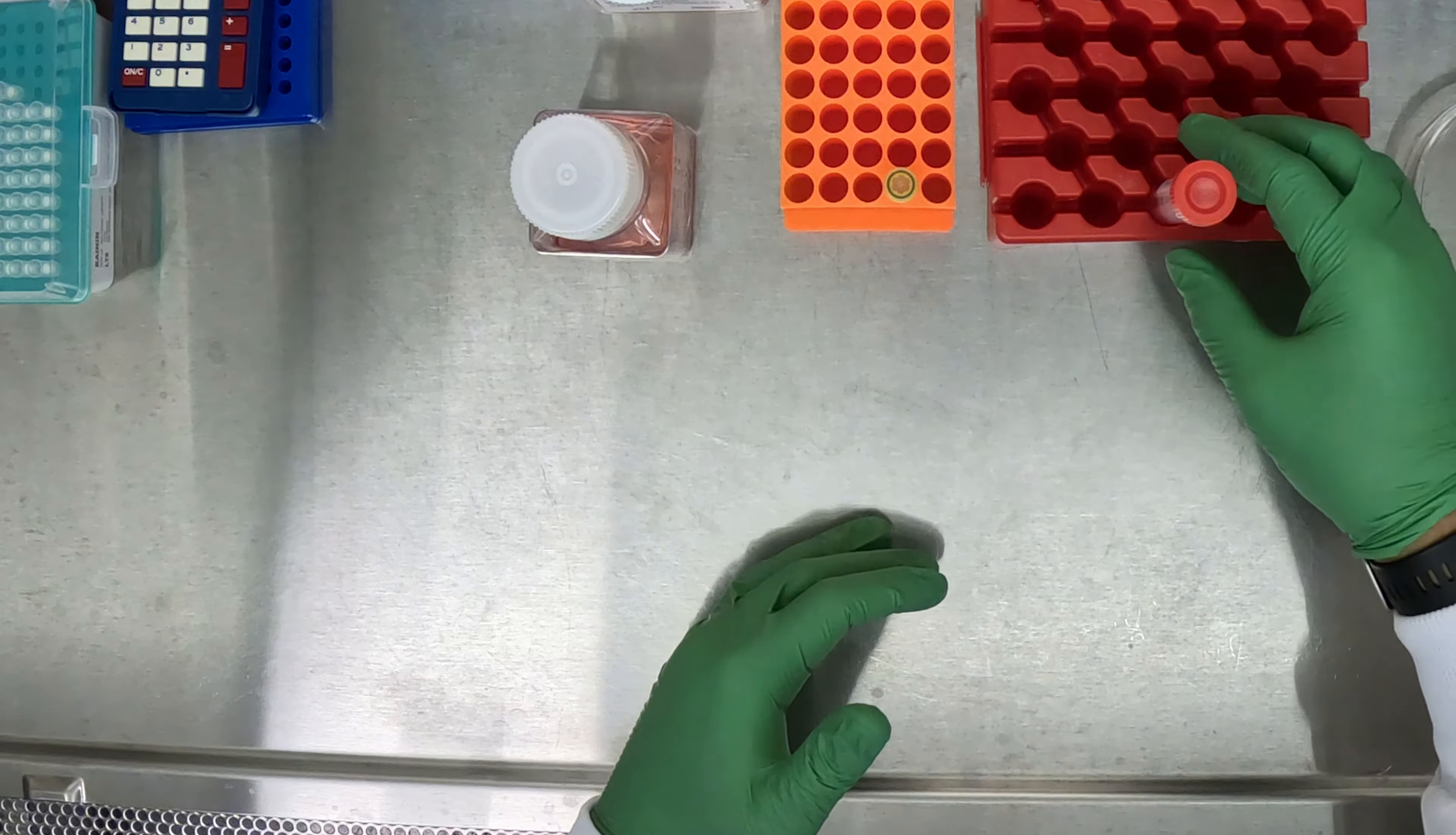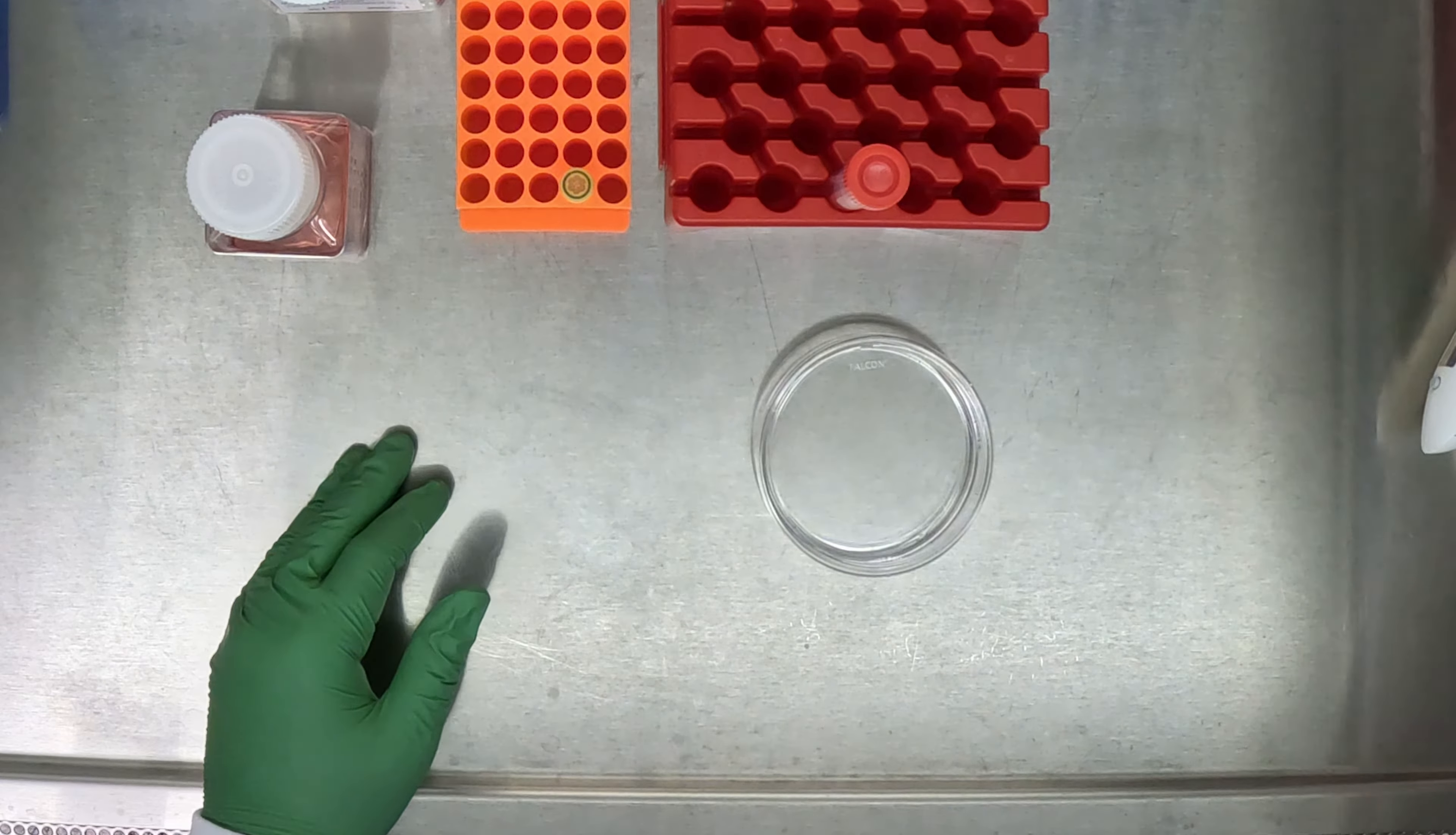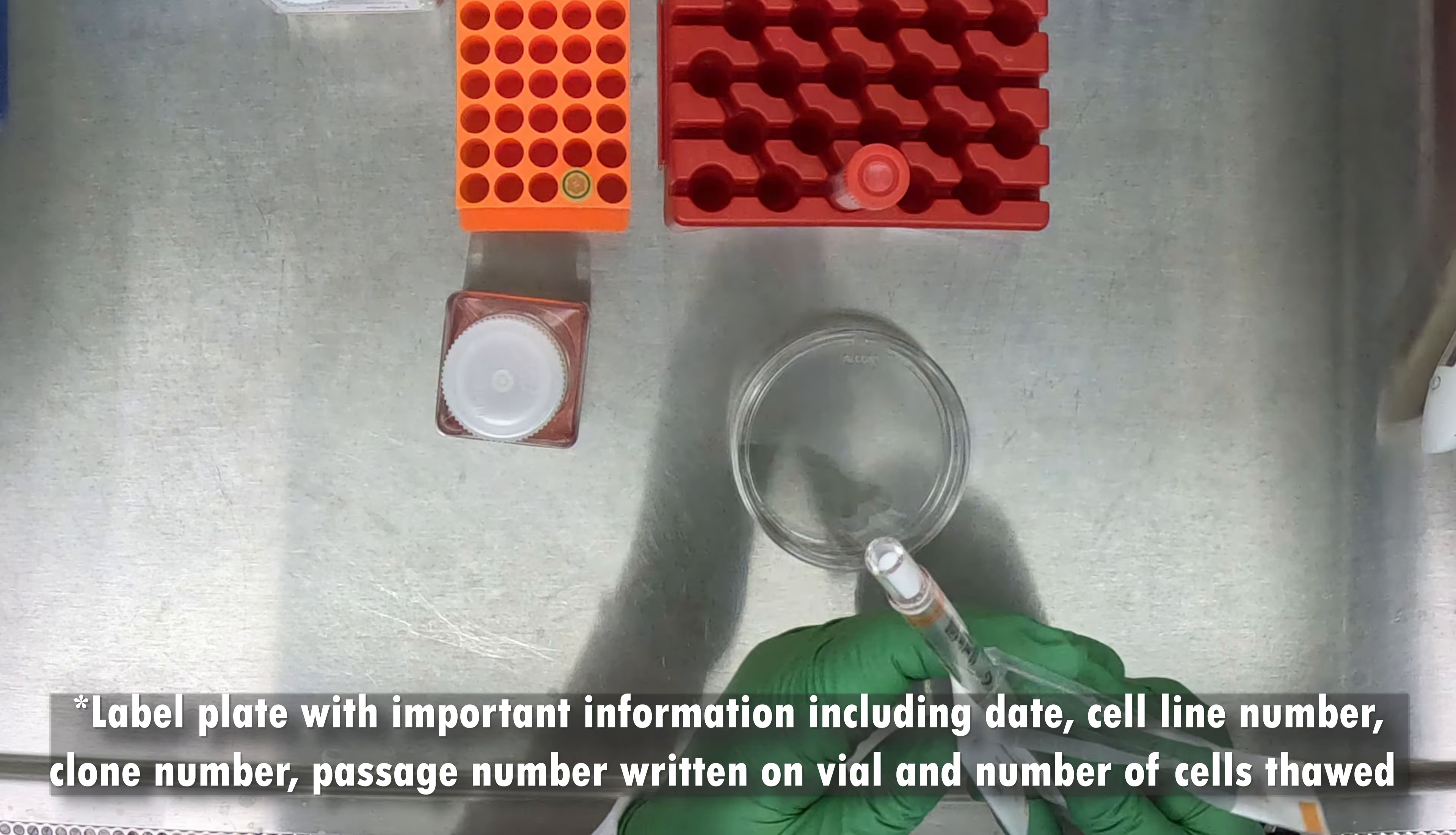Now that our cells have been concentrated at the bottom of the tube, take a quick check to make sure you see a pellet at the bottom of the cells, confirming that they are in fact there. Once you've done that, prepare your recovery dish by aspirating off your Matrigel from the dish. Once you have completely aspirated the Matrigel off of the 10cm dish, add 7ml of prepared M-Teaser plus rock inhibitor media to the recovery plate.